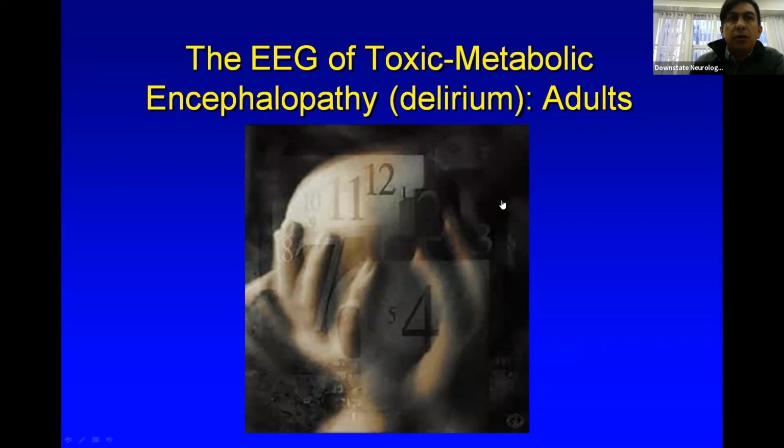Okay. Dr. Kaplan, there are some questions actually coming from the chat. The first question is from Dr. Weiss, and it's mentioned, so GPDs of greater than 2.5 hertz are considered diagnostic for status epilepticus. If you see LPDs at greater than 2.5 hertz, is this also diagnostic for focal status epilepticus?